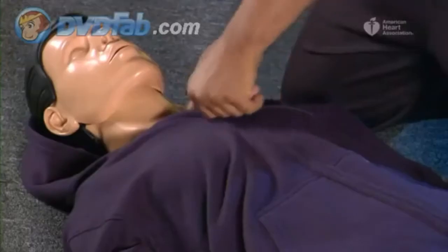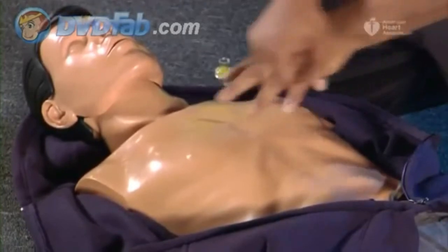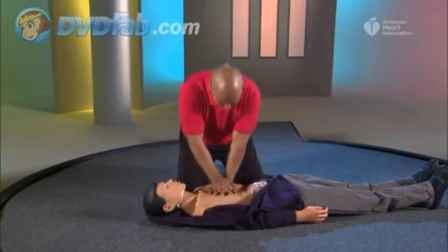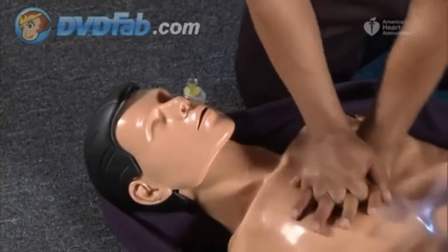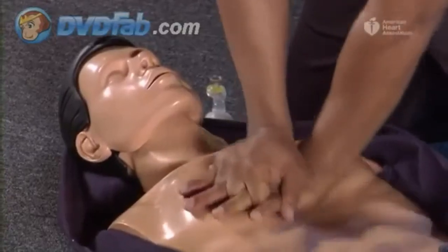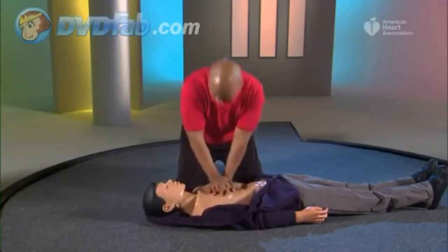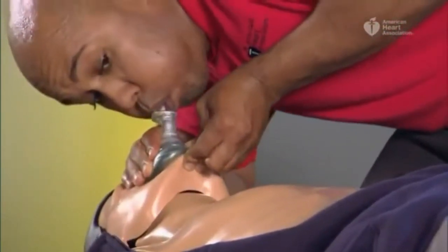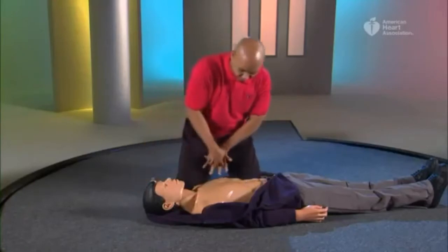If the person isn't breathing or is only gasping, move clothes out of the way and give five sets of 30 compressions and two breaths. Keep in mind that if no one comes to help you, you'll have to call for help and get the AED yourself. Open the airway and give two breaths with a mask, watching for the chest to rise and repositioning the mask if necessary.